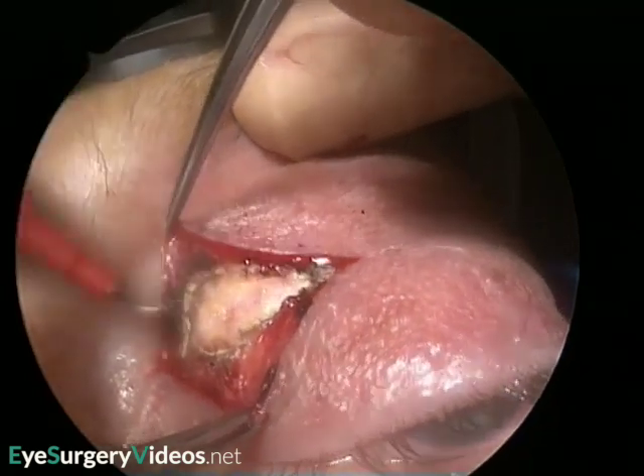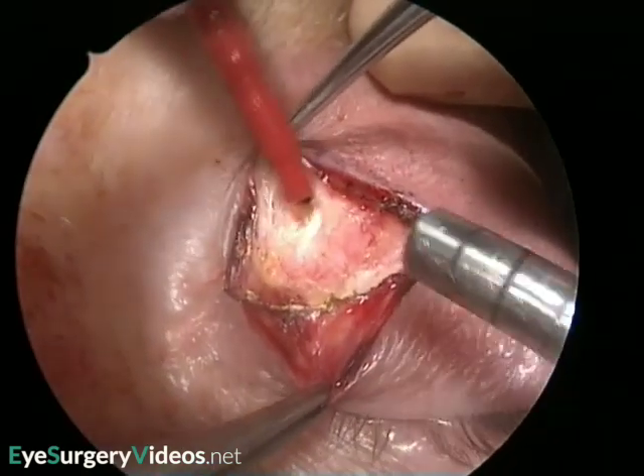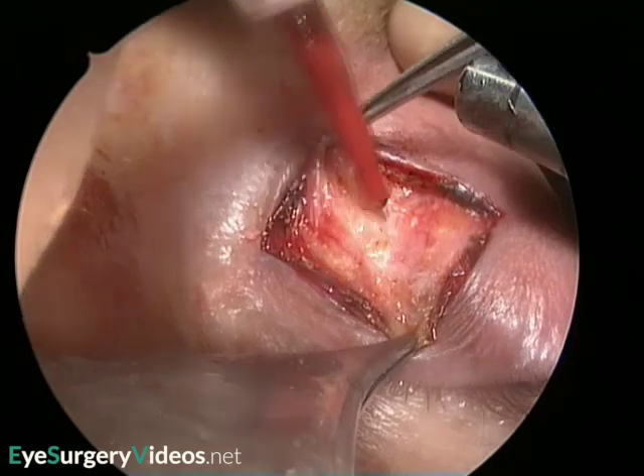The medial orbital fat pad, which is denser and paler than the other fat pads, is gently teased out, taking great care never to put much traction on it.